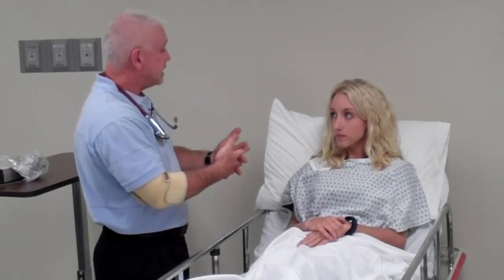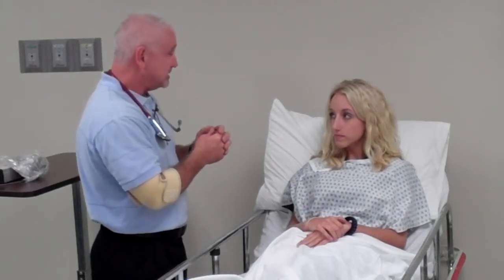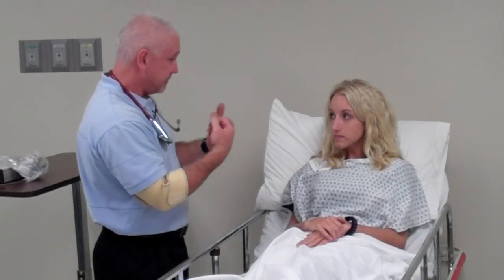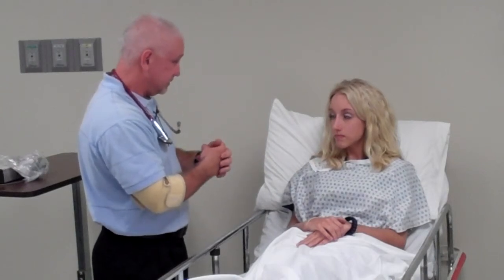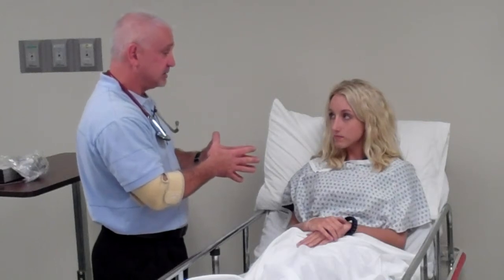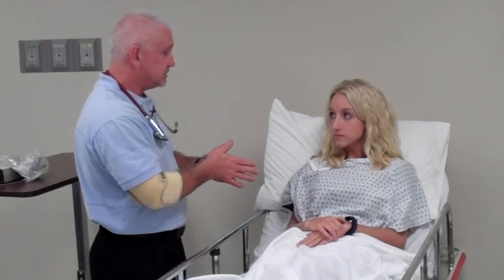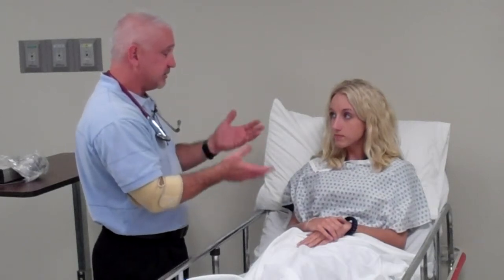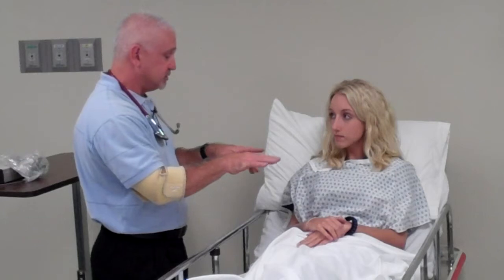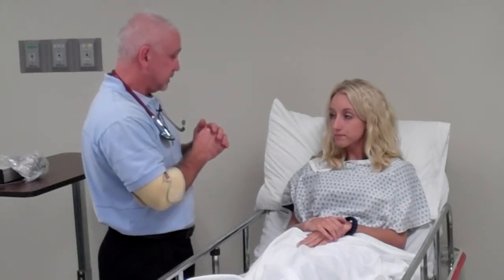Okay. Also, while you're wearing oxygen, if for some reason you start feeling lightheaded, dizzy, or nauseous, I need you to make sure you tell the nurse so that they can let me know so I can come and reassess you. Okay? So again, no smoking, limit the use of electronic devices. If you're going to use lotions, check with nursing first. And if you start feeling lightheaded, dizzy, nauseous, tremors, or shaky, let the nurse know, and then they're going to let me know.